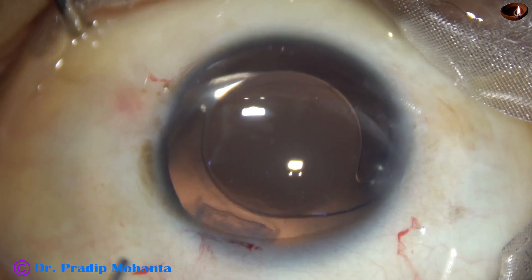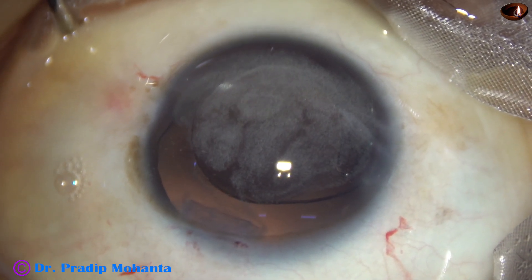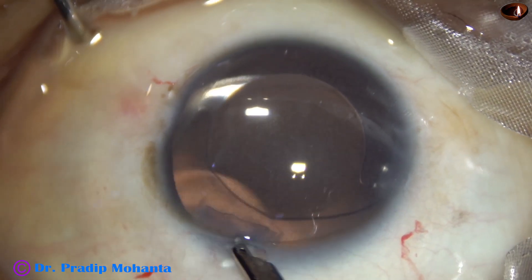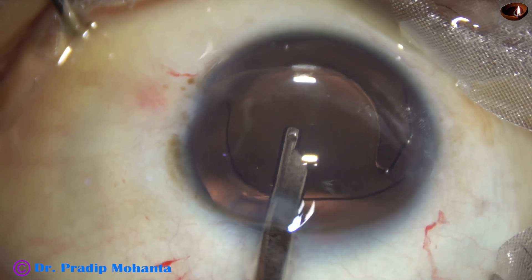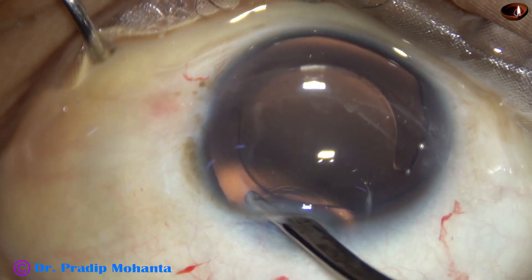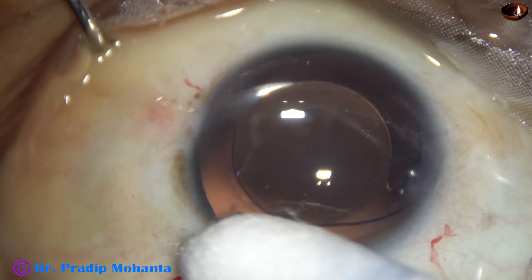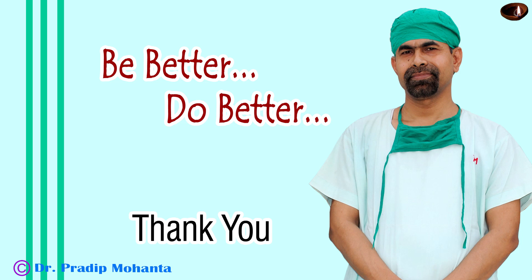And now, to check if there is any vitreous strand prolapsing into the anterior chamber, I injected a bit of triamcinolone acetonide. As I wash out the triamcinolone, I find that there are no vitreous strands in the anterior chamber. The capsular bag is very nicely supported, the lens is nicely placed, the optic is centered, and the patient is expected to get good vision. Retina is normal. Thank you very much for your attention. Hope this video will help you in developing your surgical skills. Be a great surgeon and serve your patients with love, respect, empathy, and great surgical competence.